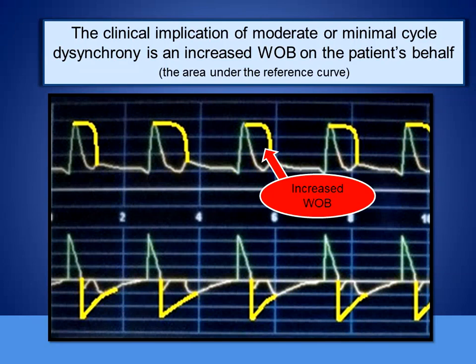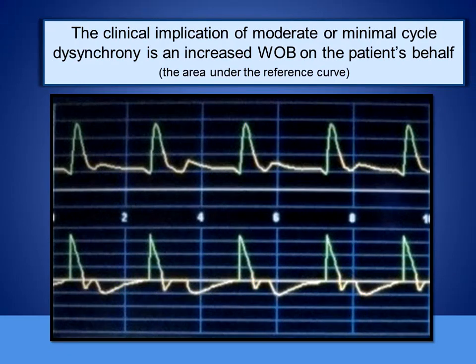So this leads me to, I guess, this question. If you had your patient on VCAC, and this is what they looked like, or you had your patient on VCAC and they had inadequate flow, that's what they looked like. Is this what you would call a resting mode of ventilation? And I think that answer is absolutely no. A resting mode of ventilation is defined by that which alleviates work on the patient's behalf, not necessarily the acronym or the alphabet soup that sits in front of that name of the mode. That's not what defines a resting mode. It's just the alleviation of work. And in this particular patient, there's significant work on the patient's behalf.